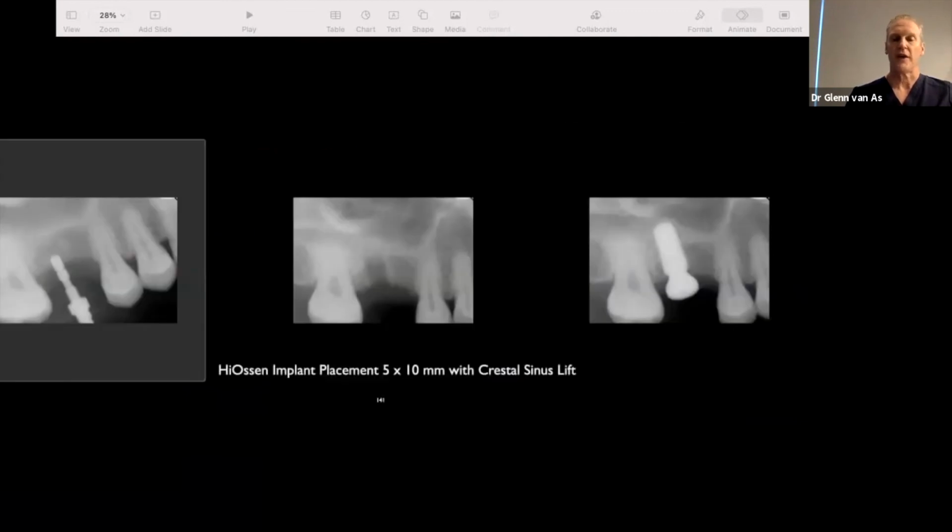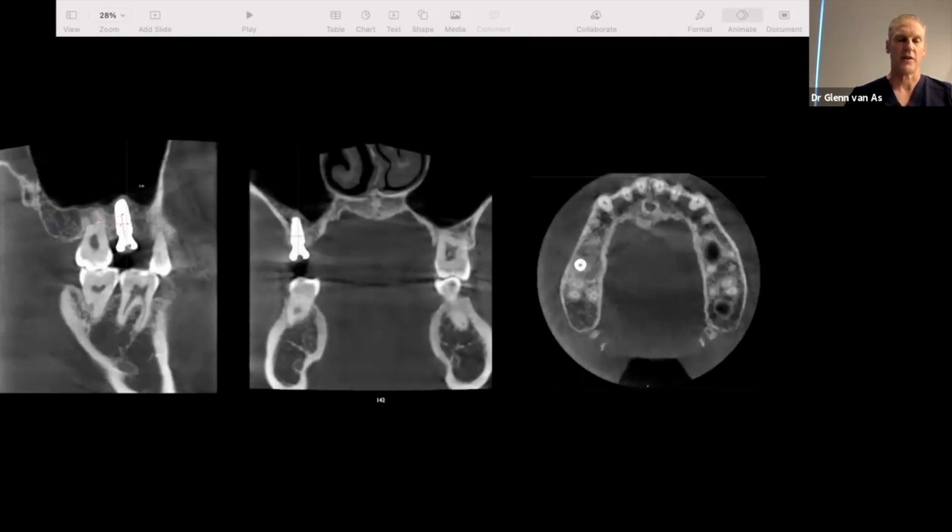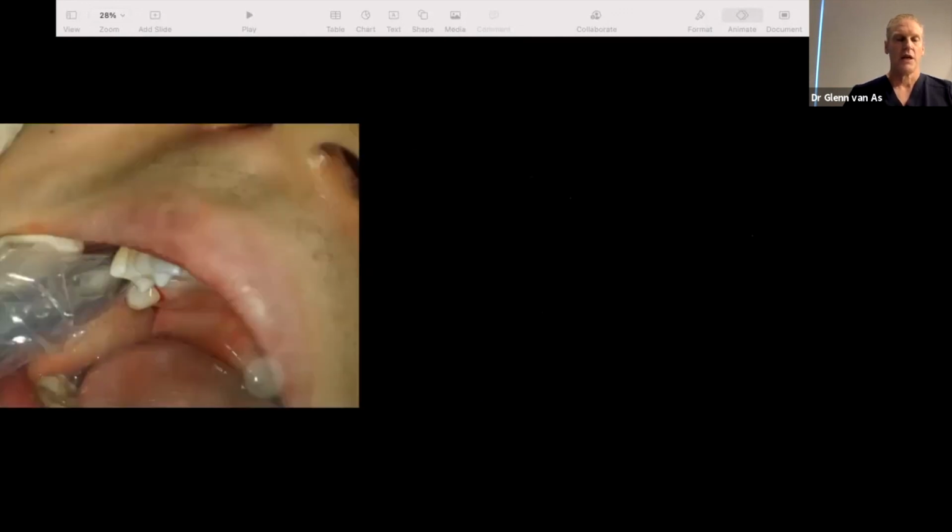So again, it drifted. If I had to be picky, I can say that for sure I got a lift here, and perhaps I'd like to have this in a better position. Here we are, post-operative CBCT, and you can see the implant there. You can see the approach to the sinus. You can see there the lateral view and the sinus lining. I don't routinely do post-operative CBCTs, but I did in this case to make sure that everything was good. And here we are again, utilizing the laser with a barrier on it over the site.